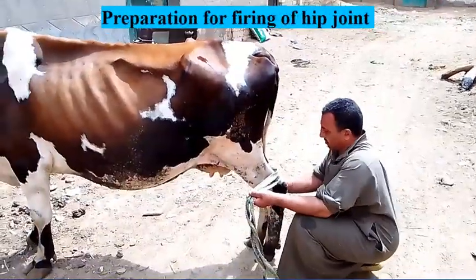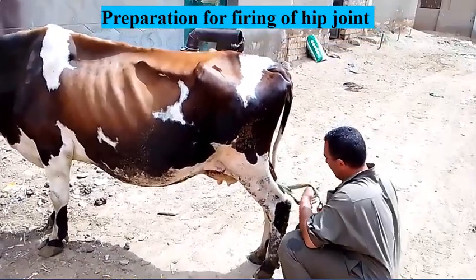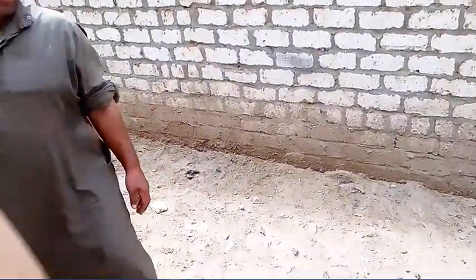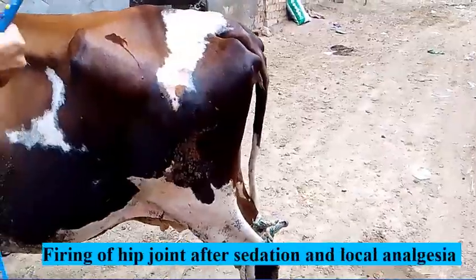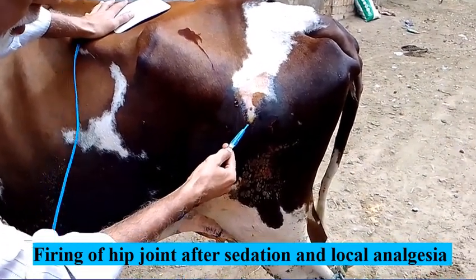Now we prepare the firing of the hip joint. The area is shaved and disinfected, then local infiltration analgesia is injected. Firing is applied at 6 points to stimulate fibrosis and fixation of the joint.